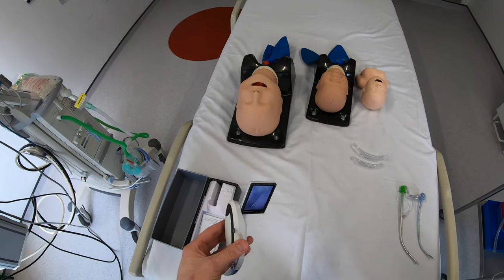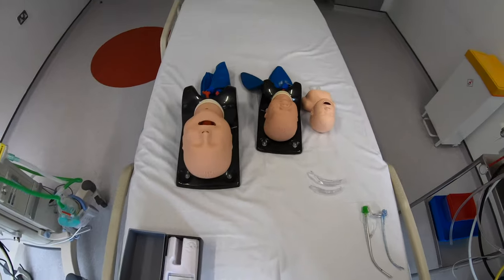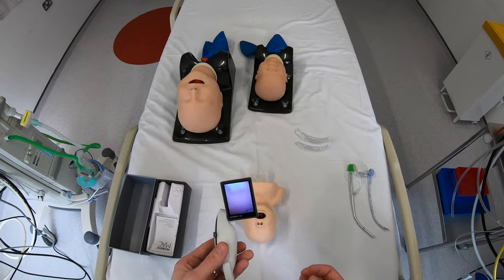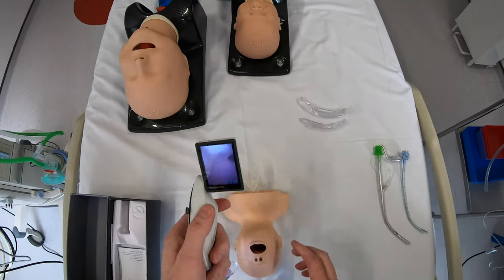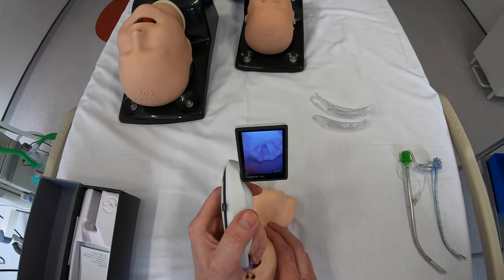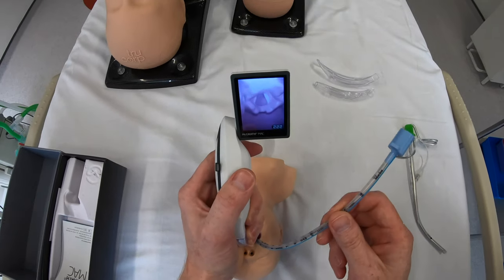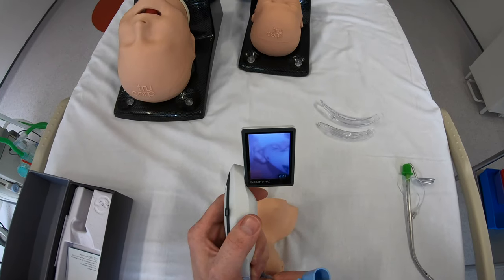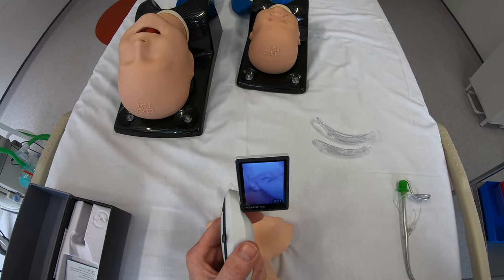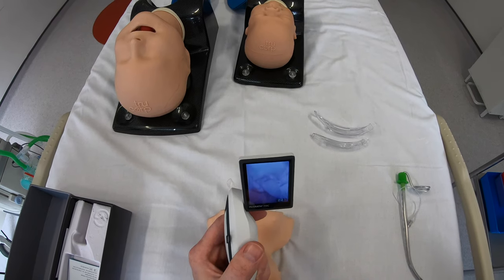Let's see how it performs doing an intubation on the models. First we have a normal neonatal model with the size MAC1 blade. No problem getting that into the mouth — we've got a nice full view of the laryngeal opening, plenty of space to deliver the tube, and it goes straight to the cords without any problem. It's really nice how well focused the markers are on the tube; you'd have no difficulty positioning the tube at the black markers at the level of the vocal cords.